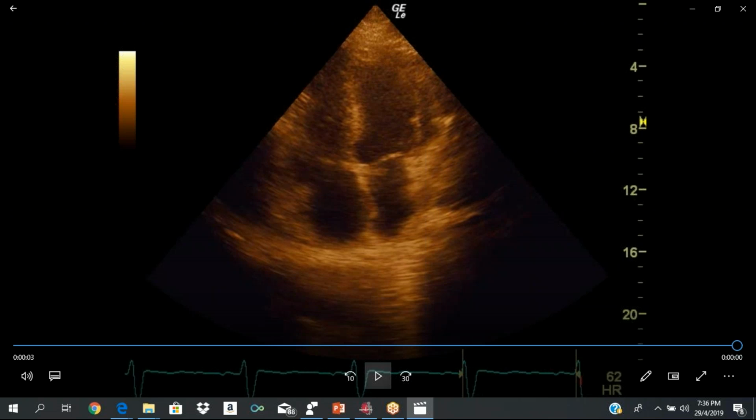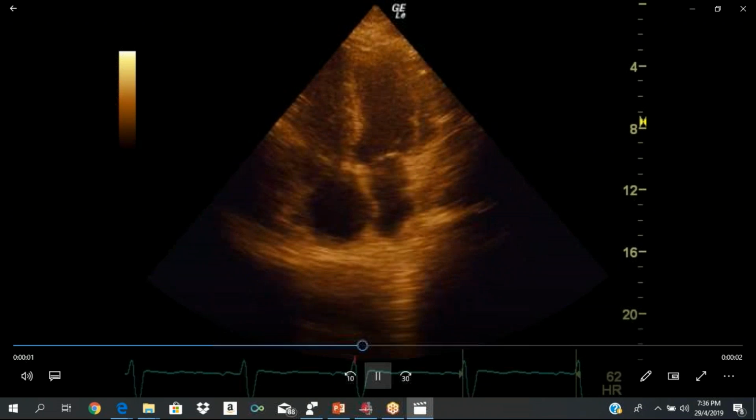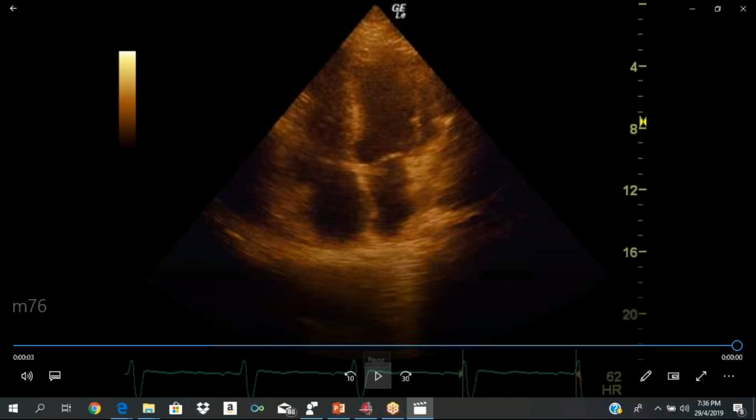The exam is going to be the 18th of May, so you have a little over 2 weeks to prepare for it. Okay. All right. So I just want to go over this so that you have an idea of what a reduced ejection fraction looks like.